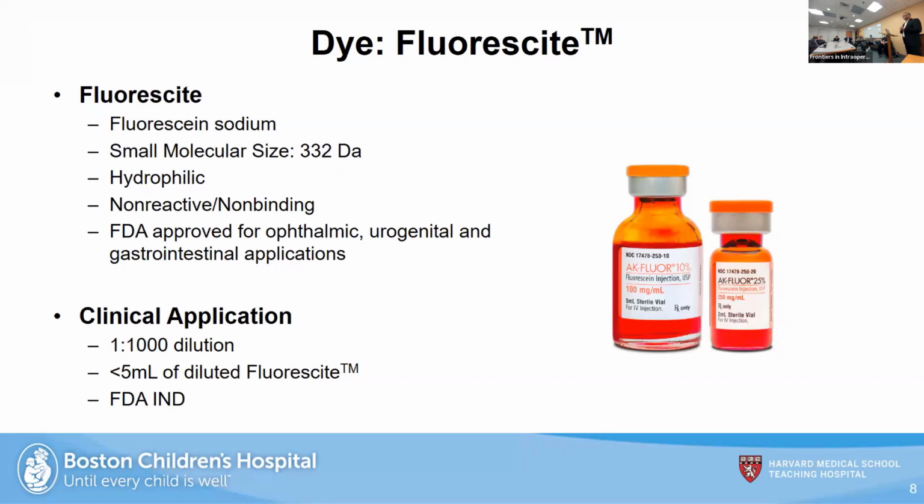For our case, we have acquired an FDA IND. We use a 1 to 1,000 dilution of the dye, and that is what we see is enough for visualizing the microstructures. We are authorized to use less than 5 ml, but we actually end up using much less.